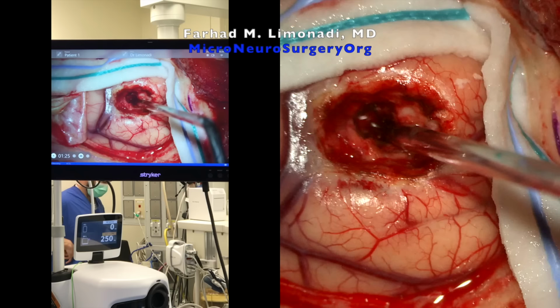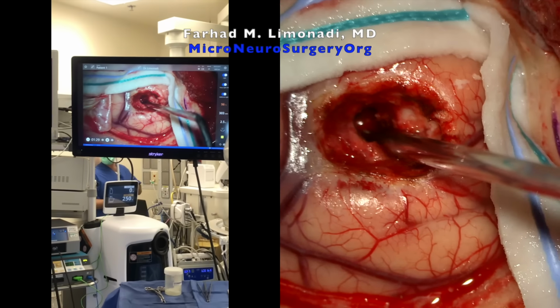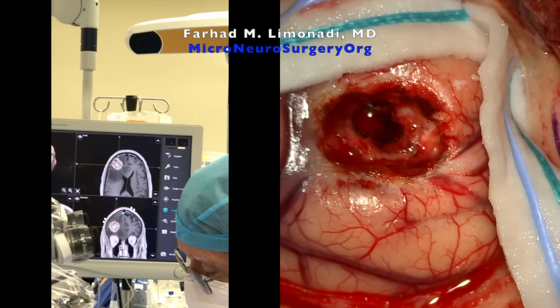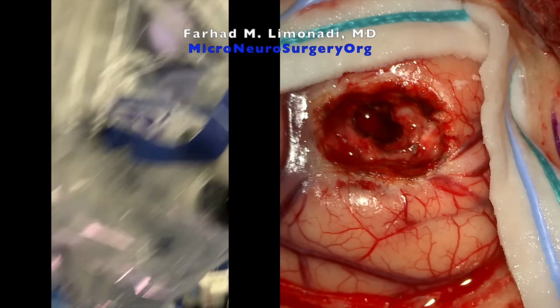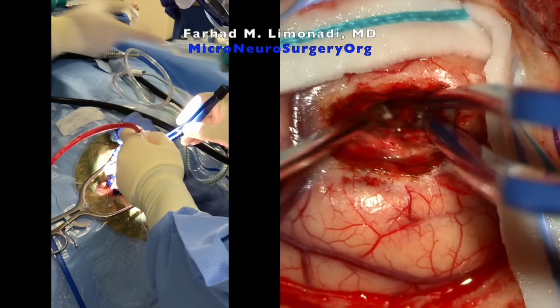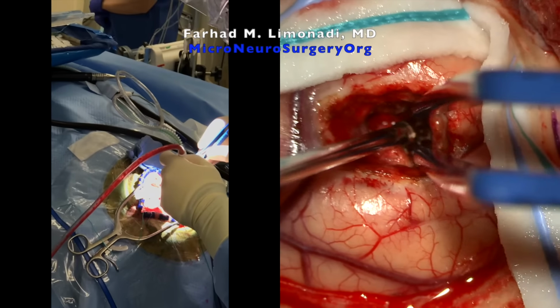That's almost the deep edge of the tumor, so we know that's how far it can go deep. And now I'm going to core it further. Can I see the bipolar, please? And on, please. We just take the volume of the tumor from the core out.